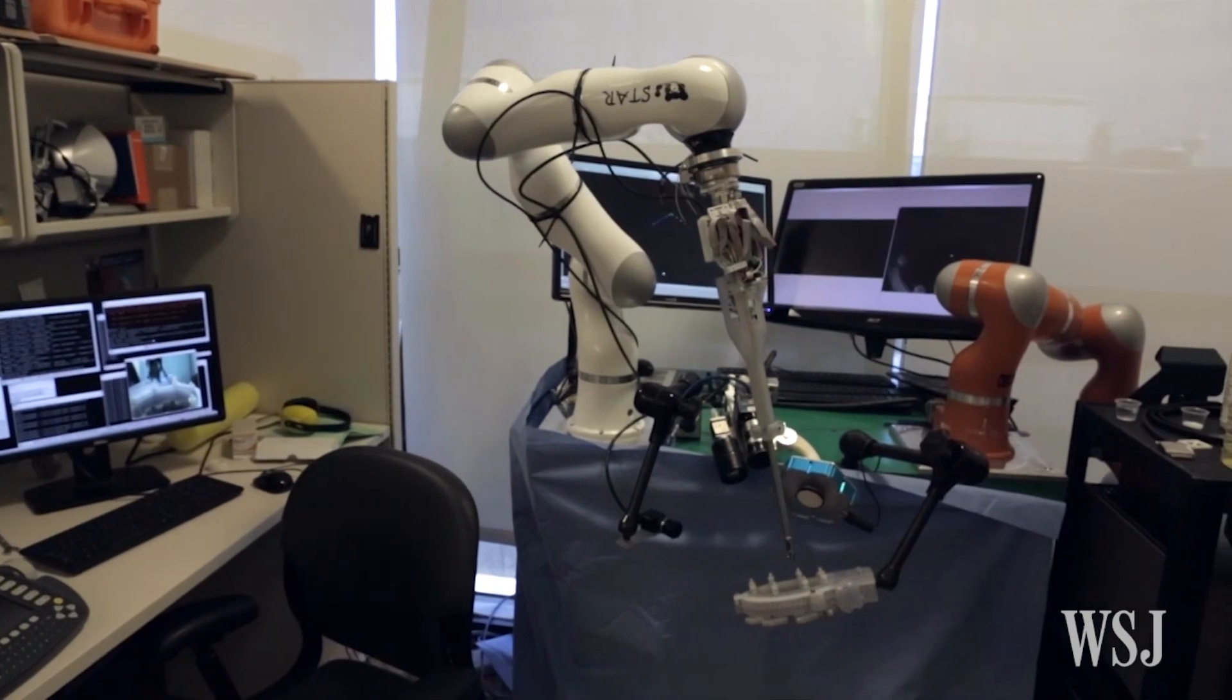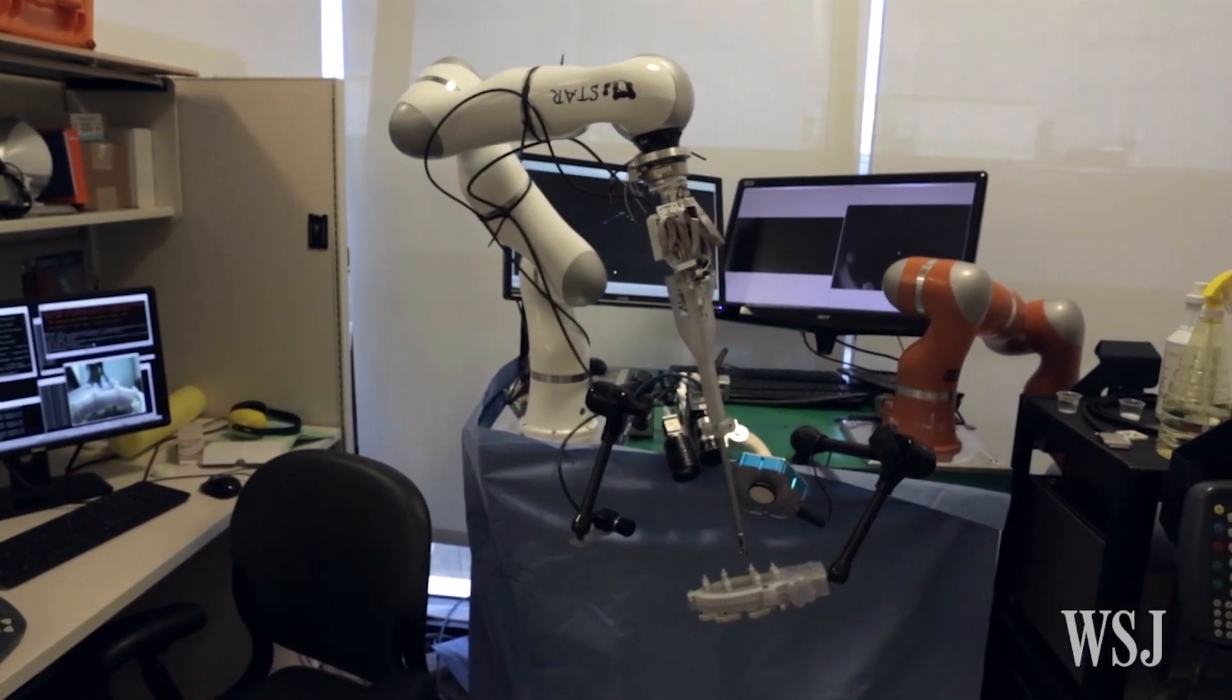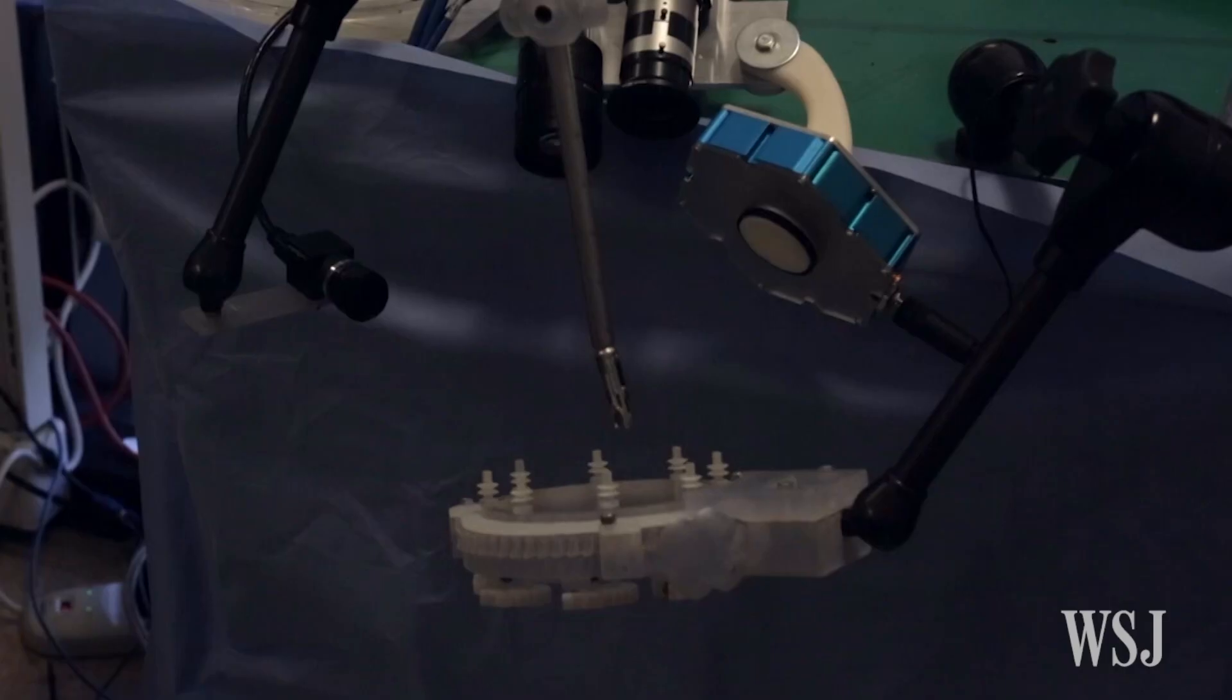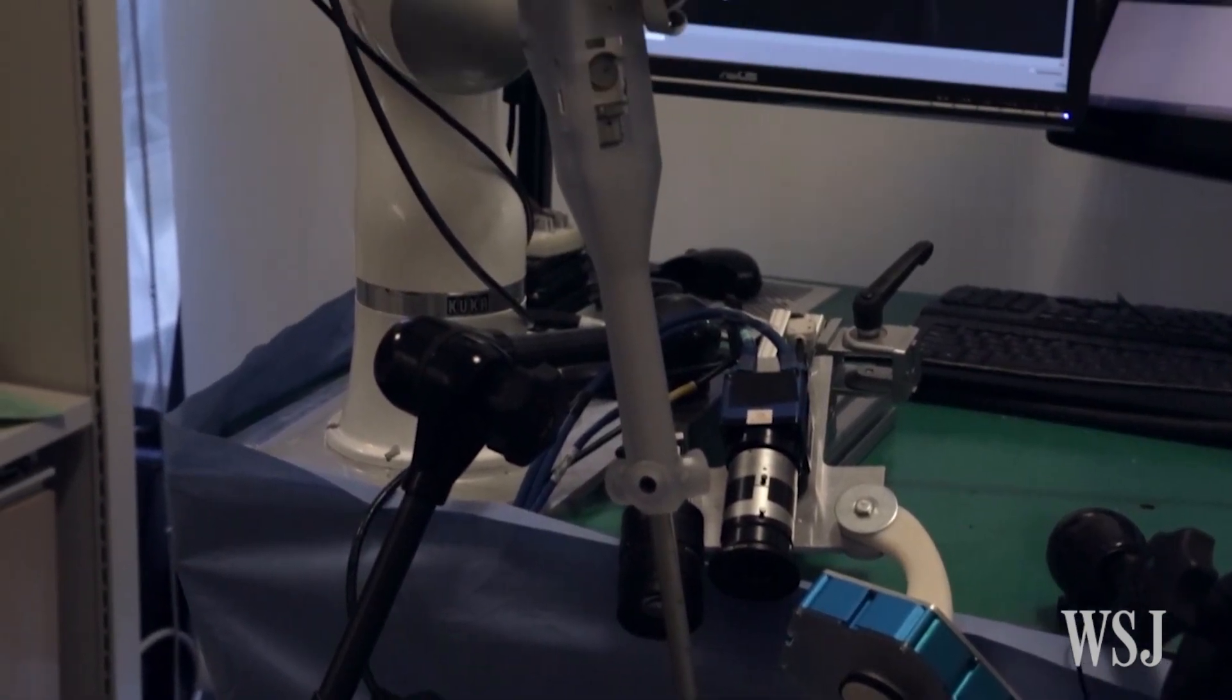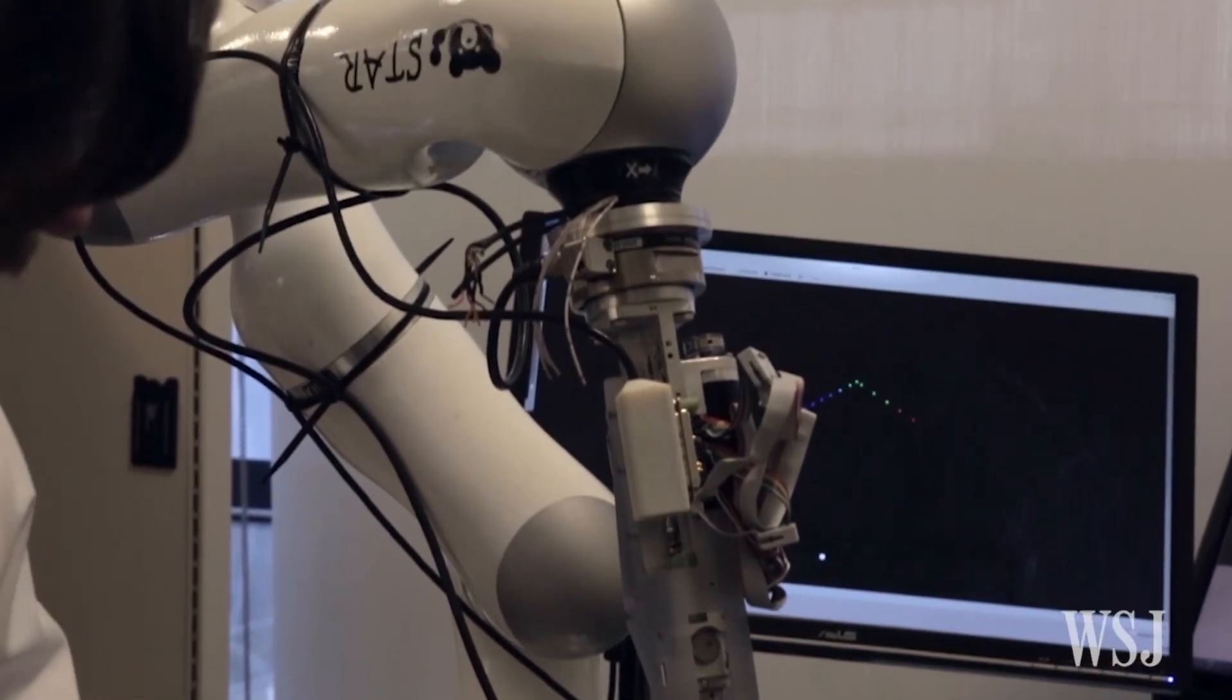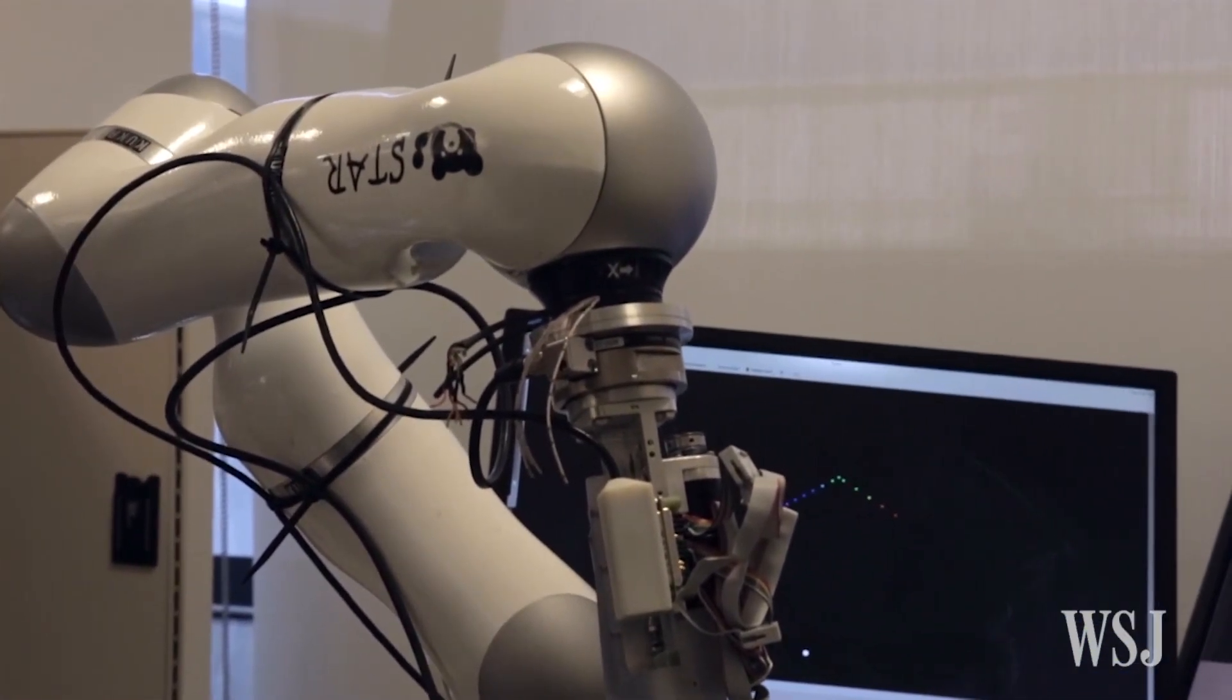The researchers designed and programmed STAR, the smart tissue autonomous robot. With robotic arms and surgical tools, STAR combines smart imaging technologies and fluorescent markers to navigate through soft tissue.